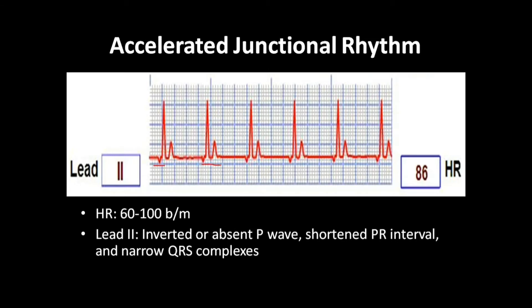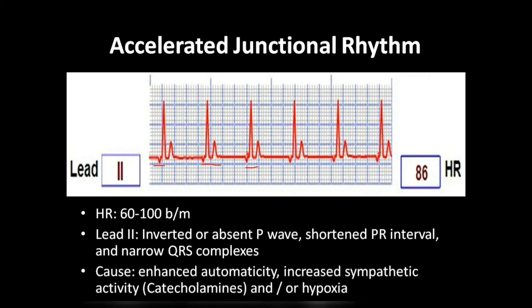You can see all the inverted P waves. The PR interval is shortened — less than 0.12 seconds, that is, less than three small squares. In all cases here, the PR interval is just 0.04 seconds, or one small square. Narrow QRS complexes are also seen.